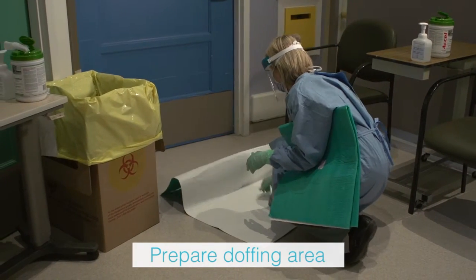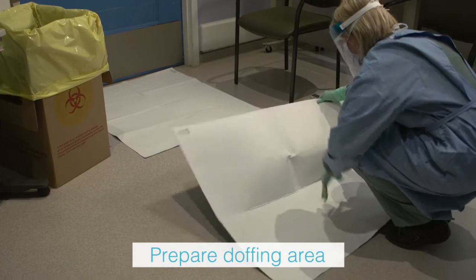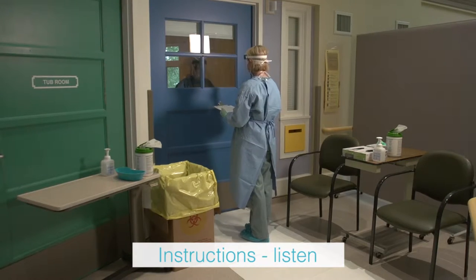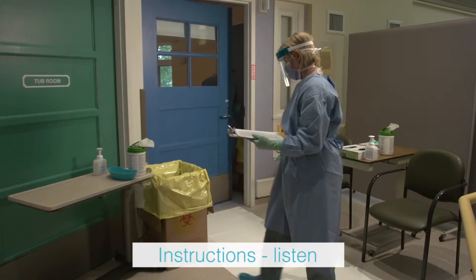The trained observer places two doffing mats on the floor of the anteroom and ensures that two chairs are available. The trained observer instructs the health care worker to avoid reflexive actions that may put them at risk, such as touching their face.